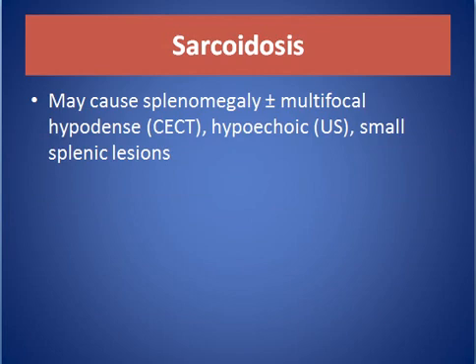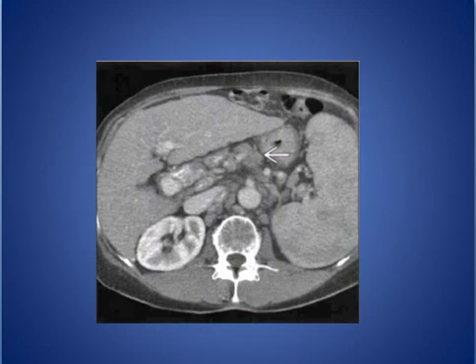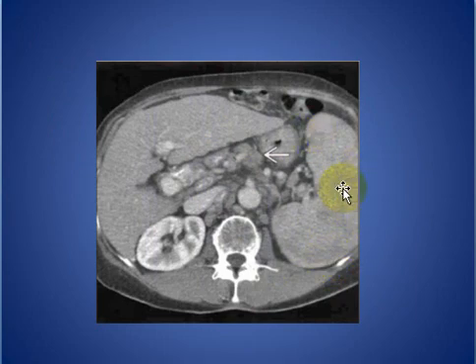Less common causes include sarcoidosis, which may cause splenomegaly with multifocal hypodense areas on contrast-enhanced CT and hypoechoic lesions on ultrasound; these lesions are small. As seen here, multiple abdominal lymph nodes and an enlarged spleen with heterogeneous enhancement and multiple hypodense areas in a patient with sarcoidosis.